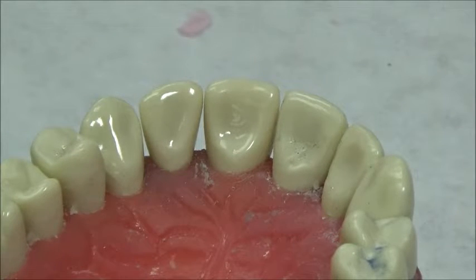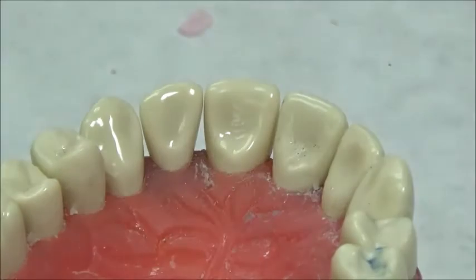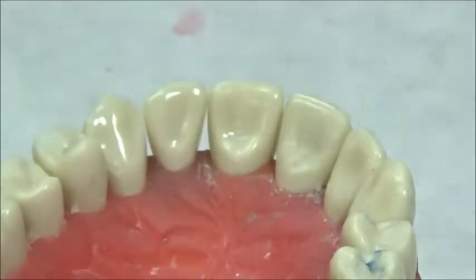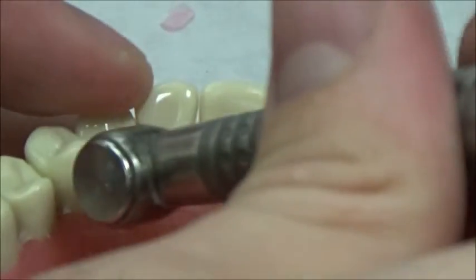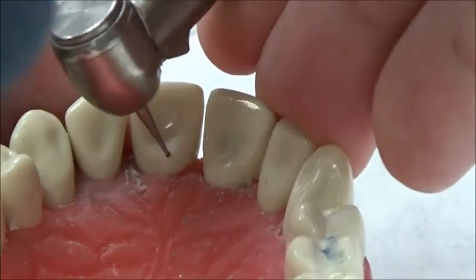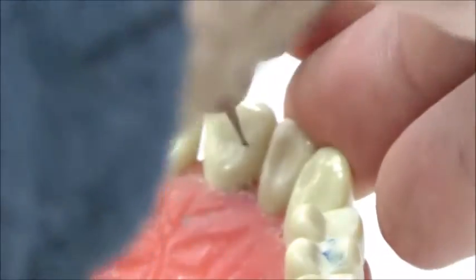Today's demonstration will cover a class 3 preparation on tooth number 9. I'll be doing this without a rubber dam, in direct vision just for the camera. I'm coming from a straightforward angle — looking directly at the tooth — but you'll essentially be coming in from kind of this angle right here when you're prepping.